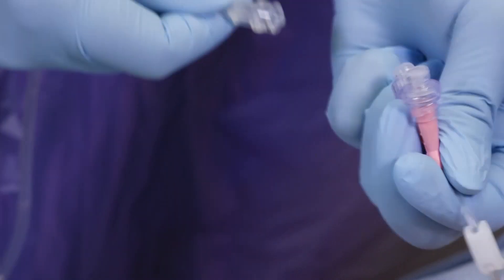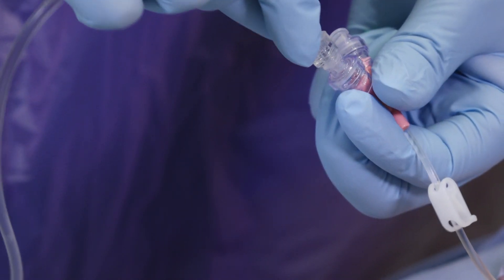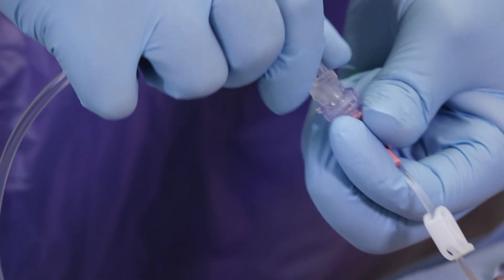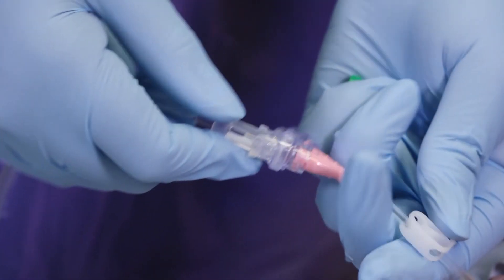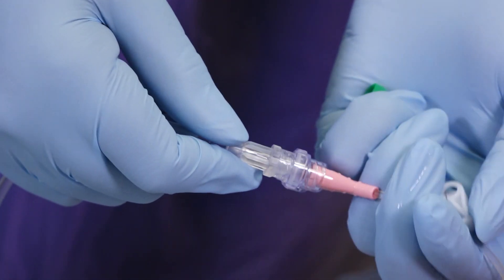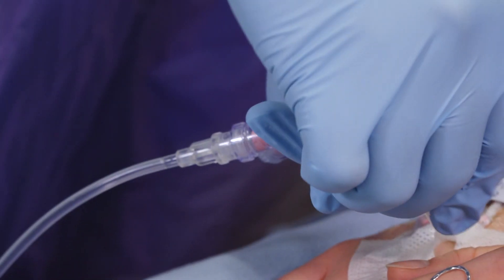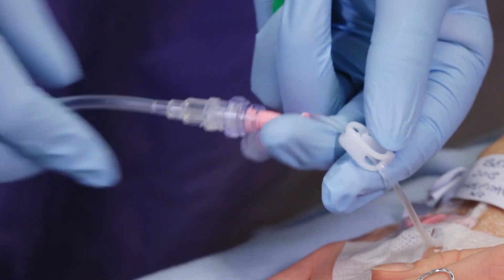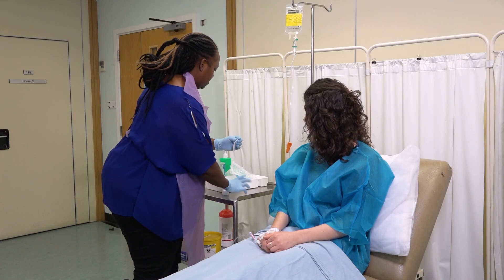Remove the cap from the administration tube, exposing the key part, and immediately connect this to the cannula. Open the clamp again to allow the fluids to infuse.